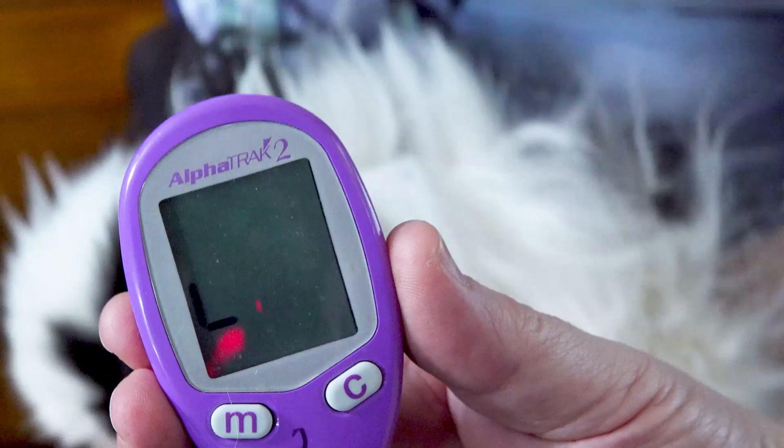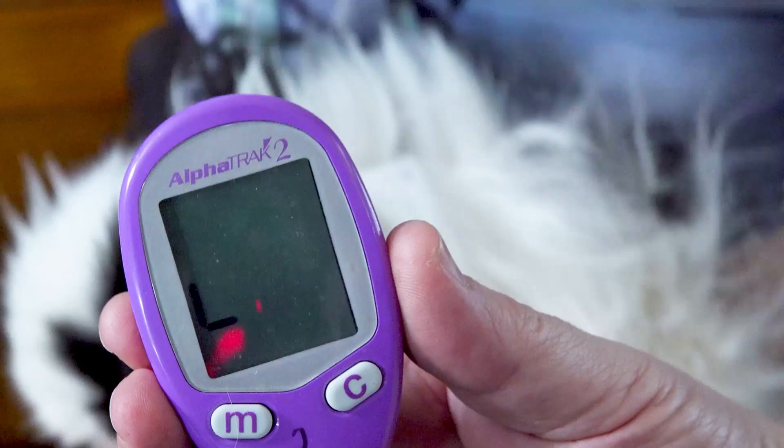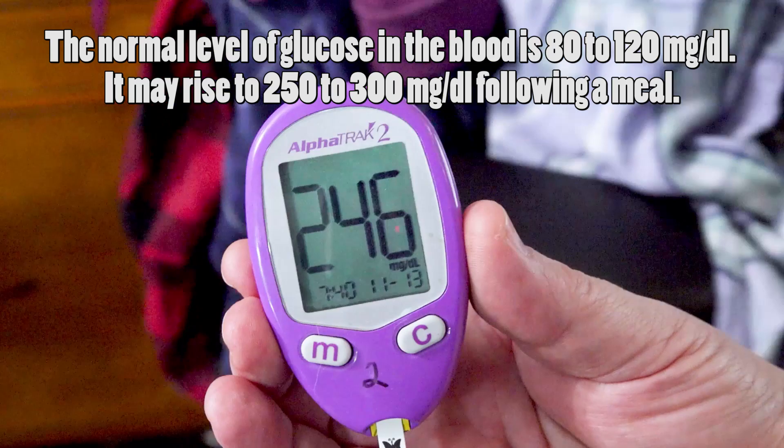Right now we wait. 246 — his number's a little bit high. We're going to record this and see how Sammy's doing.